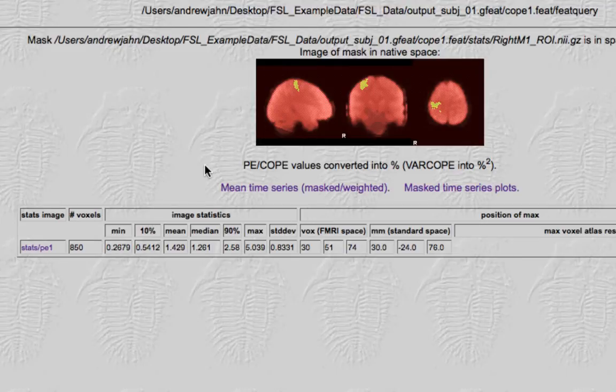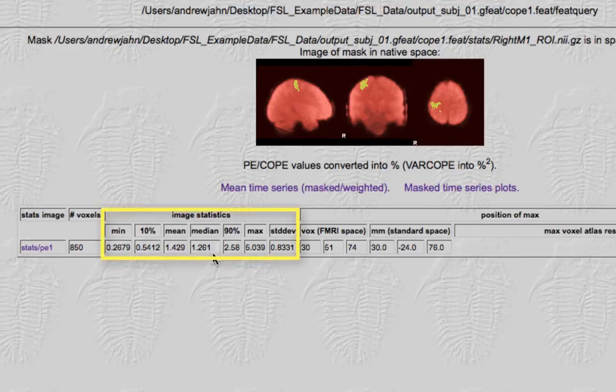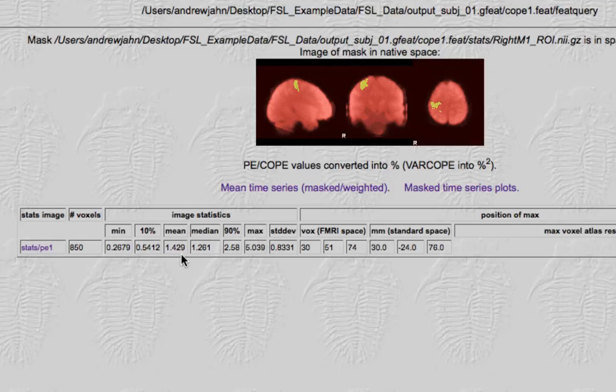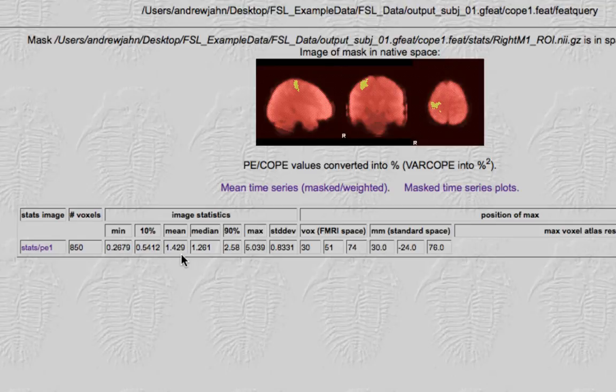And this is for the contrast of left minus right. The most important thing to focus on here is these image statistics and especially the mean. That's the average parameter estimate collapsed across all of the voxels in that region of interest. And its value is 1.429. Now, not surprisingly, because this was defined based on the contrast of left minus right, it's going to be heavily biased towards that.